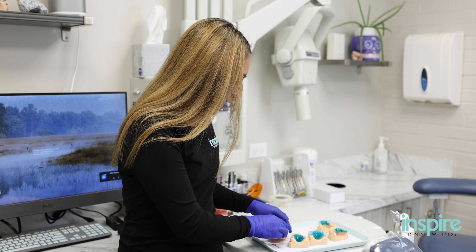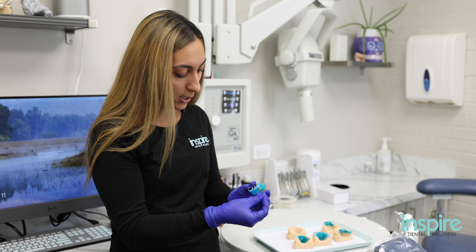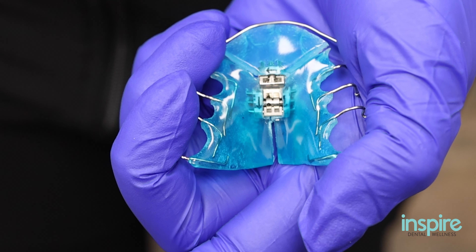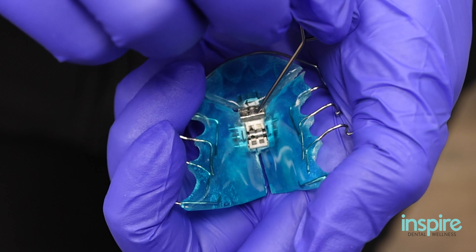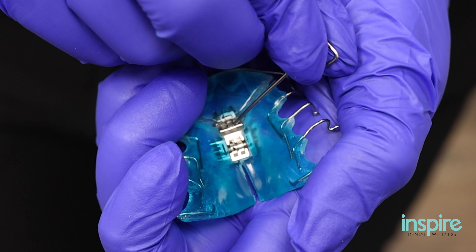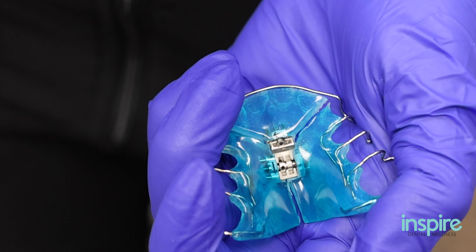For expanders that have two keyholes, it's the same idea. This one has the arrows pointing towards me. So when I go to turn the top keyhole, when I'm holding it, it's on my right hand side — turn the key towards me in the direction of the arrow, take it out. That's one full turn.